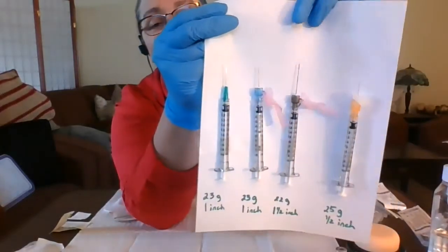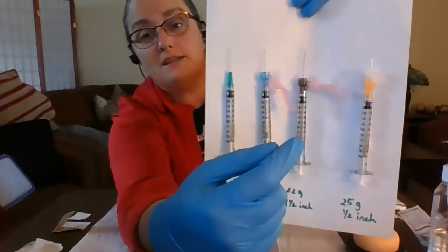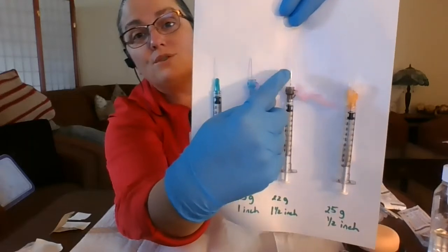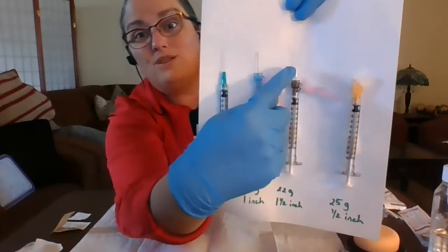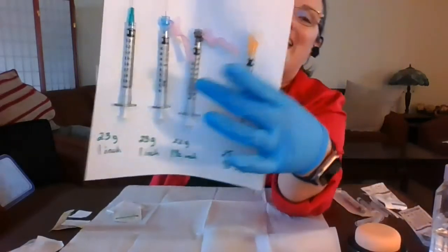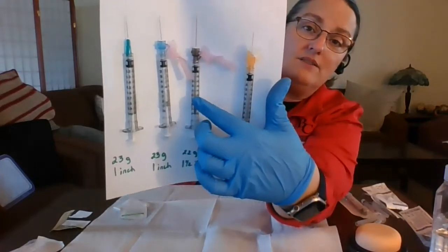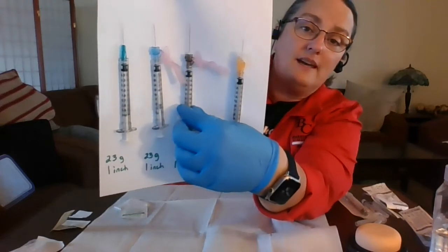If we needed to give an injection into the gluteus muscle, into the buttocks, then we might have to use a longer needle in order to reach that muscle, because we have to get through a little more subcutaneous tissue to get to that. So you can see that this one is a 1.5 inch. Now, depending on our supplies, we may only have the longer needles in order to give vaccines. So we just have to think about how far we are inserting that needle.